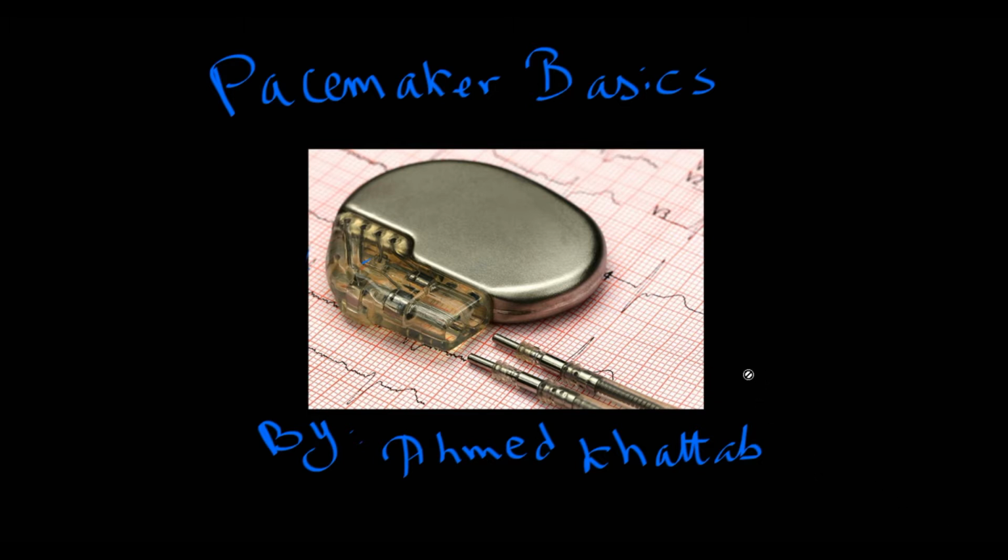As you can see in the initial picture, and as I think you're all aware, this is the pacemaker generator or the pacemaker can. This bit is called the pacemaker header, and this is where the leads rest. So the leads are basically enabling us to send and receive electrical signals to and from the heart.